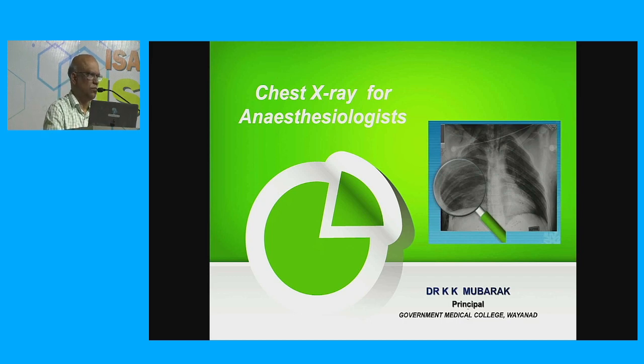It is used as a pre-anesthetic workup in patients with known cardiorespiratory diseases. It is used for follow-up and management following any event like chest trauma, or in order to look for any foreign body insertion, following an event for follow-up and management. Then chest X-ray can be taken in patients more than 65 years of age for pre-anesthetic workup.